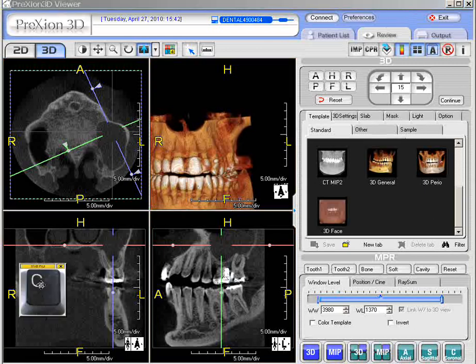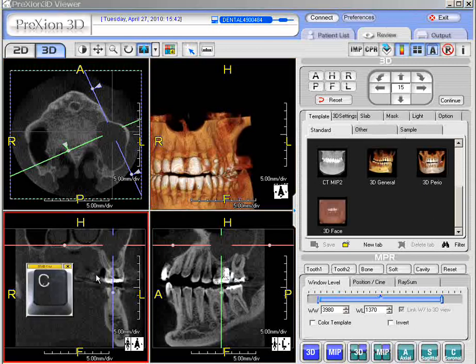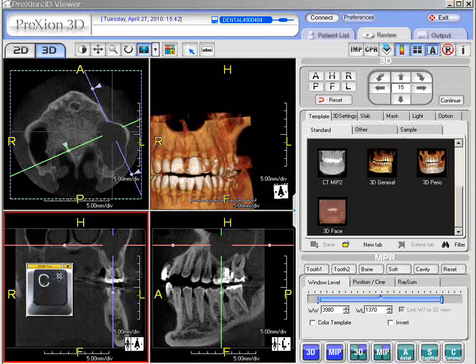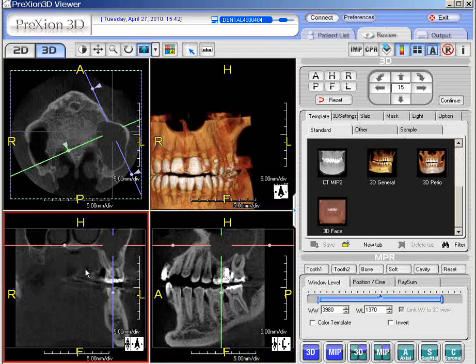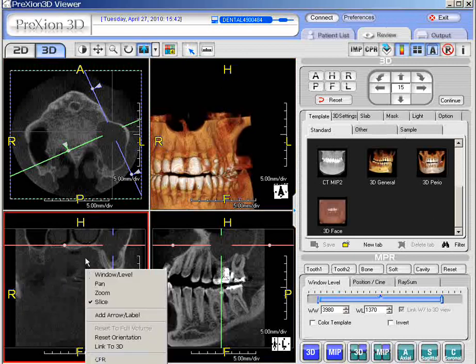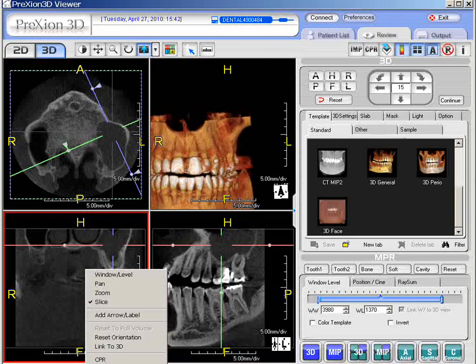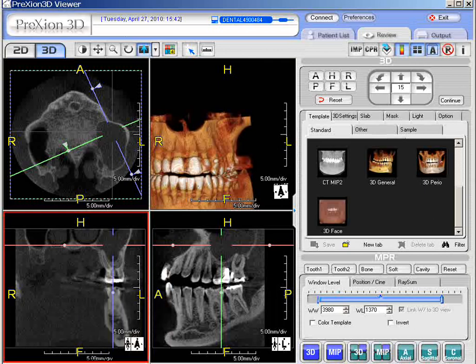Whether you just press C on the keyboard with the highlighted red box around the frame, or right-click, you can capture whatever the red frame shows as a single capture. If you want to capture all views, press Capture All Views and it captures everything on the screen. To demonstrate that, we capture all views.